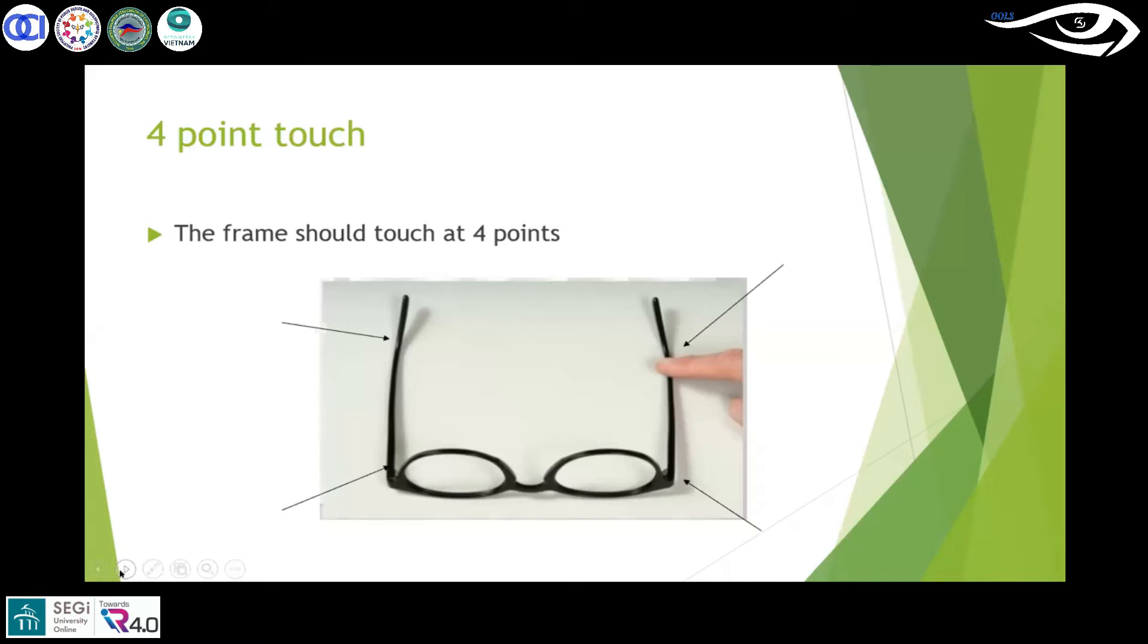This is something called a four-point touch. When we do fitting, it is not only the fitting on the face; we also have to see this on a plain surface. This is maybe one of the most important things for a comfortable fitting. These are the four points I have marked.